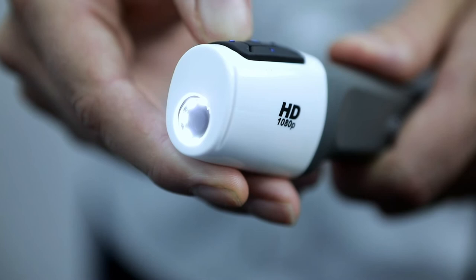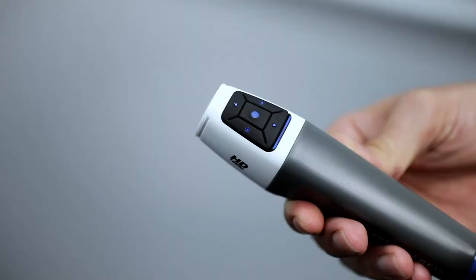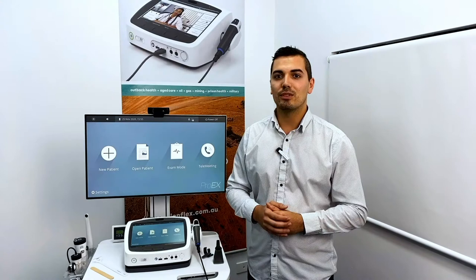The LED lights have three levels of brightness as well as a fourth setting that turns the LED lights completely off. Finally, push the central button to capture an image on the Pro EX.